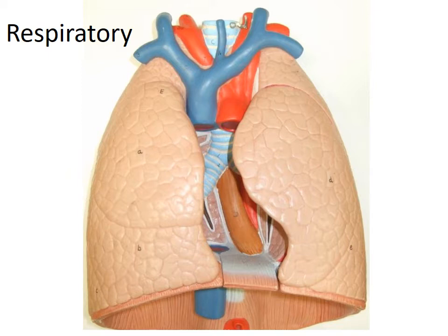But we're going to learn that it only holds close to that. Our body stops our ability to breathe in when we get close to 6 liters. Because remember, it's fragile tissue. We don't want to overinflate it.